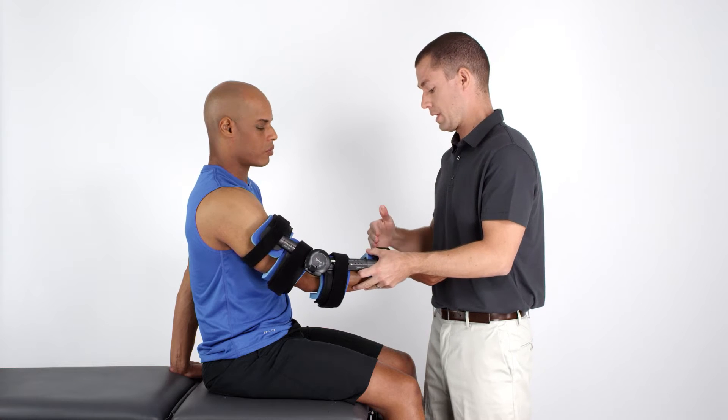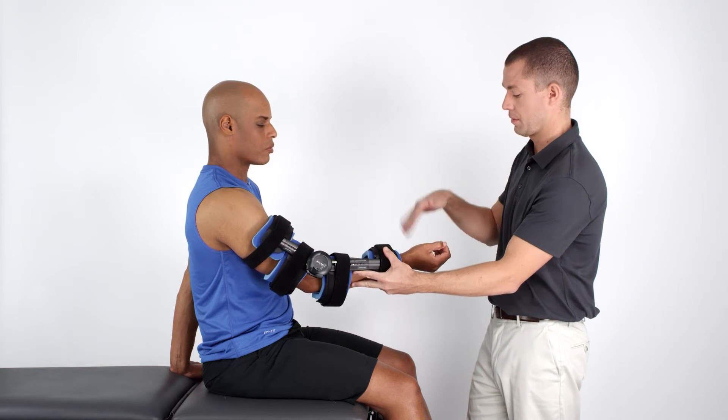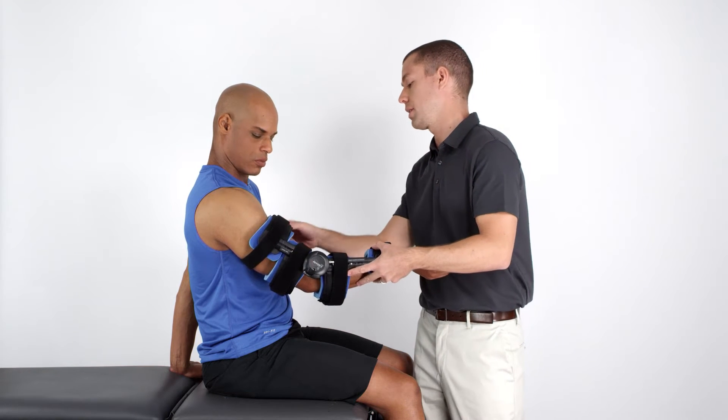Adjust the distal cuff to a length that does not restrict wrist motion. The proximal strut should not impinge on the medial axillary area.